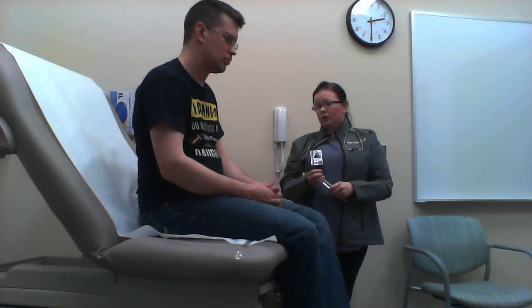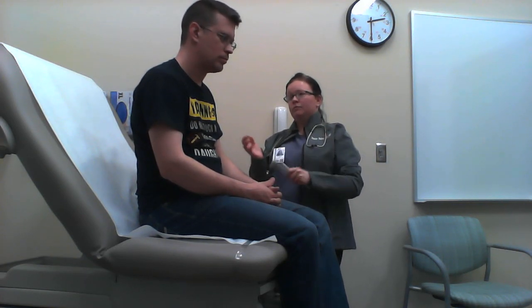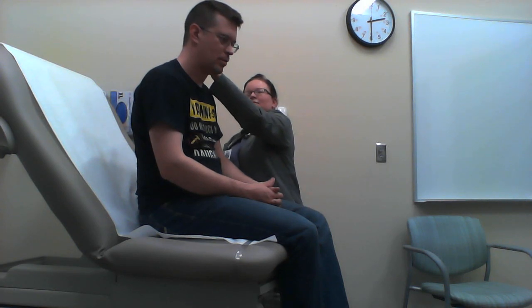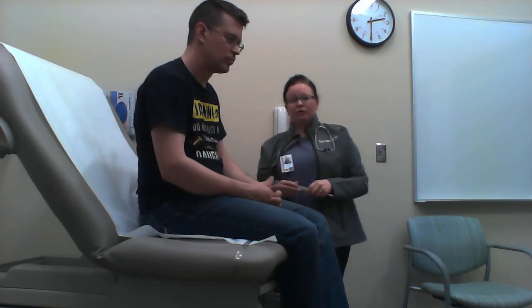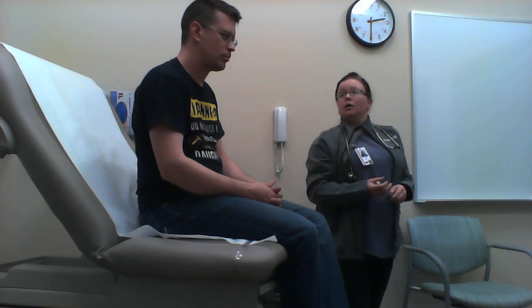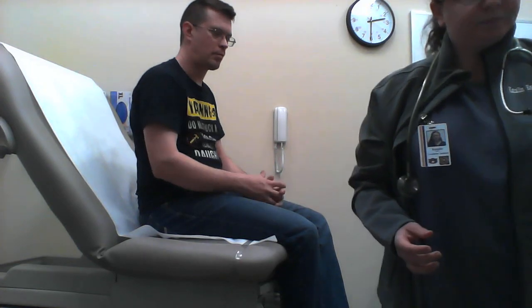All right. Now, I'm going to put this behind your ear. Tell me when you stop hearing it. There. I can hear it still that way. Okay. And air conduction is greater than bone conduction, which is a normal finding. And again, we would be doing this on both sides, but for the video, we're only going to do it on one. All right. We're going to move on to the nose.